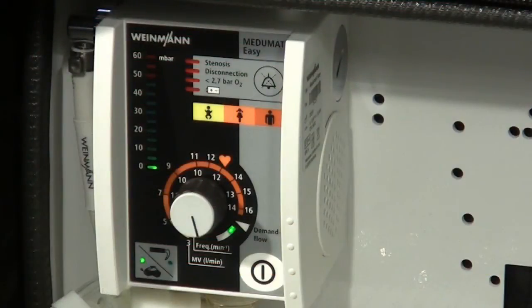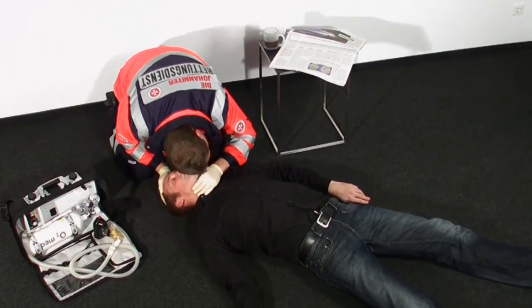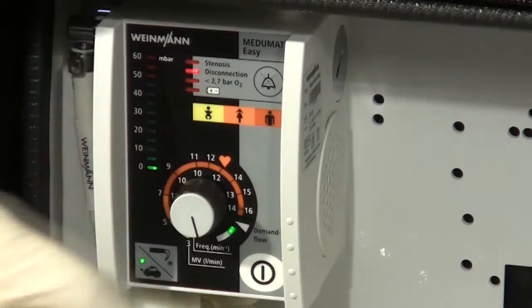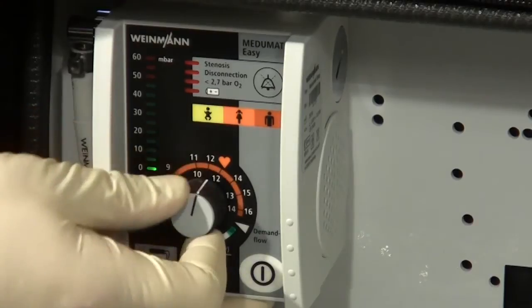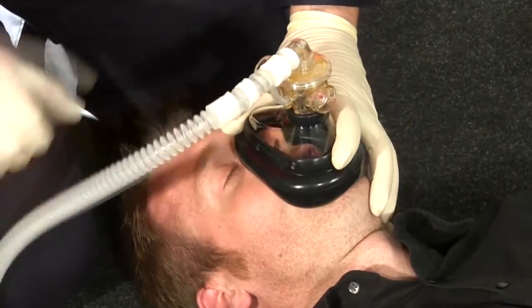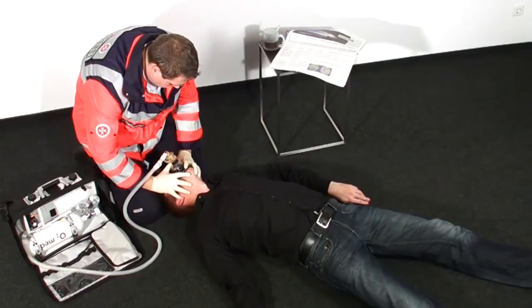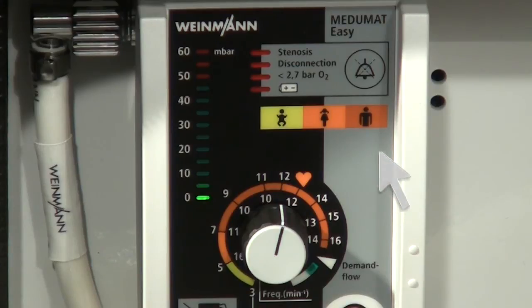Ventilation. If the patient ceases to breathe for 15 seconds — in the event of sudden respiratory arrest, for example — Mejumat Easy will immediately emit the disconnection alarm and a corresponding voice prompt. After the user has checked the patient's vital signs and ruled out an obstruction in the airways, possibly caused by vomit, he can simply switch Mejumat Easy to mechanical ventilation. Use the colour coding and patient group symbols for adult, juvenile or child to make the correct ventilation parameter settings.